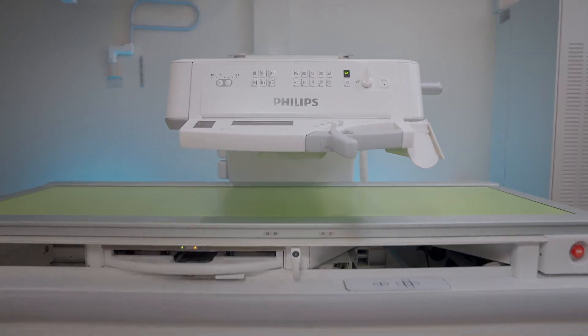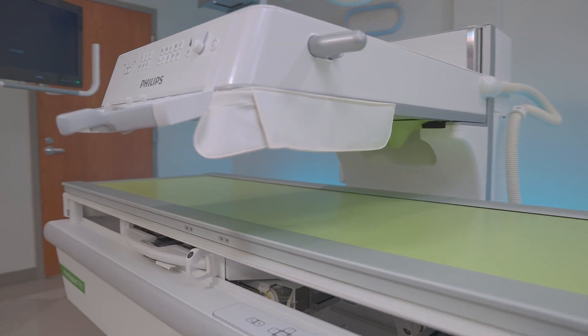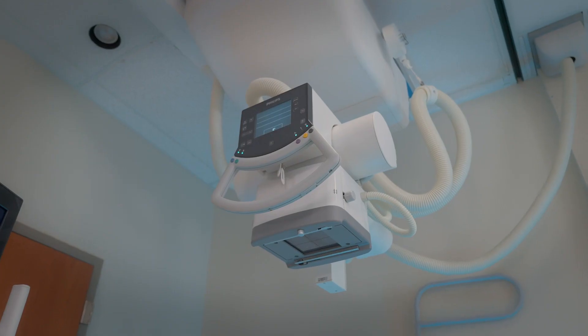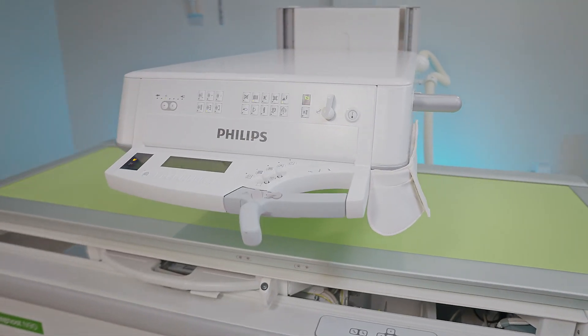Hello, today we're going to talk about the Philips Proxy Diagnost N90 nearby fluoroscopy system. It's a two-in-one system that includes x-ray as well as fluoroscopy.